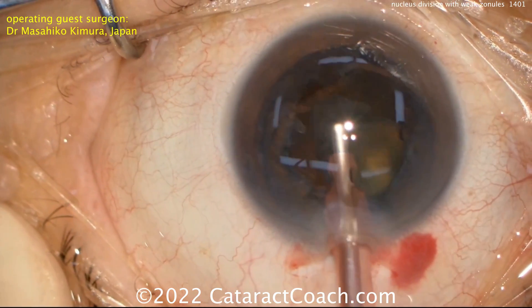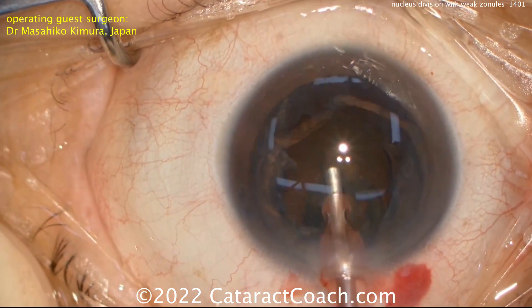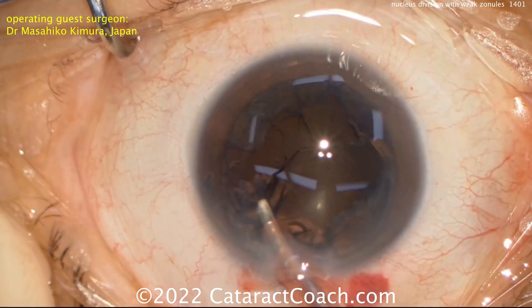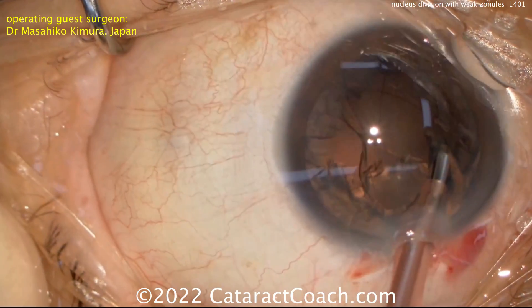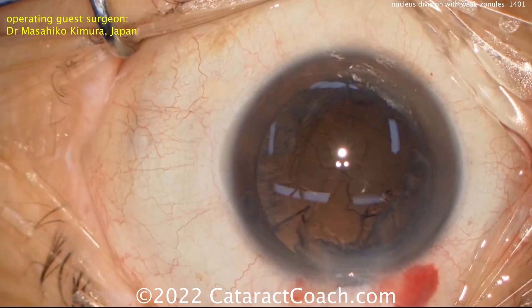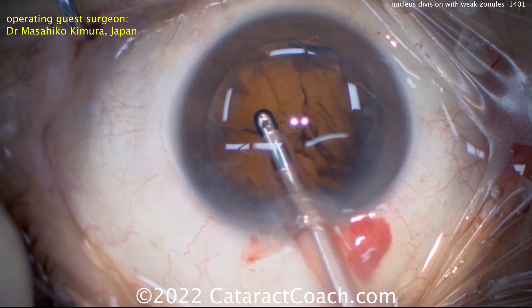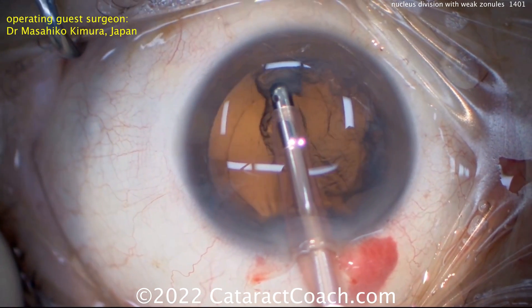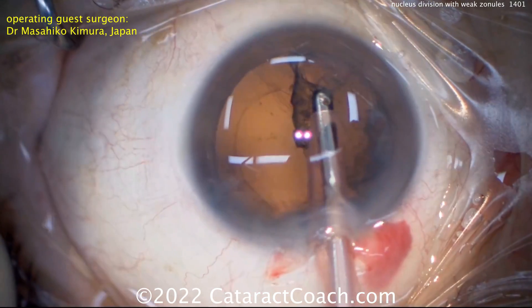Both these videos are very interesting. I like that they are good techniques to use in cases where you do have suspected zonular weakness. What are other techniques you could use? Well, you could also make a generous rhexis and try to get that nucleus out of the bag — not necessarily with only hydrodissection, but you can actually use your chopper to lift the nucleus or endonucleus out of the capsular bag and emulsify it at about the iris plane, without worrying about operating in the bag and causing further zonular weakness.